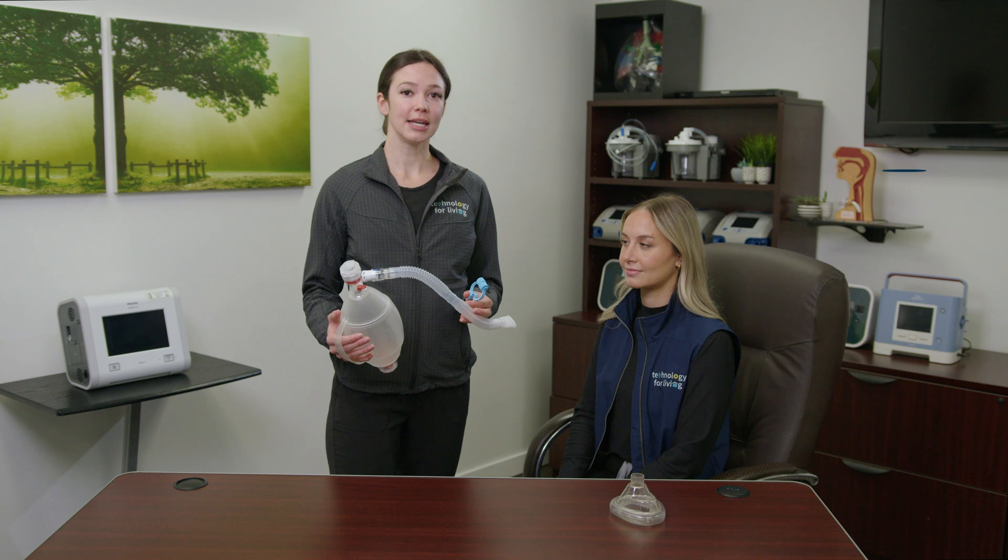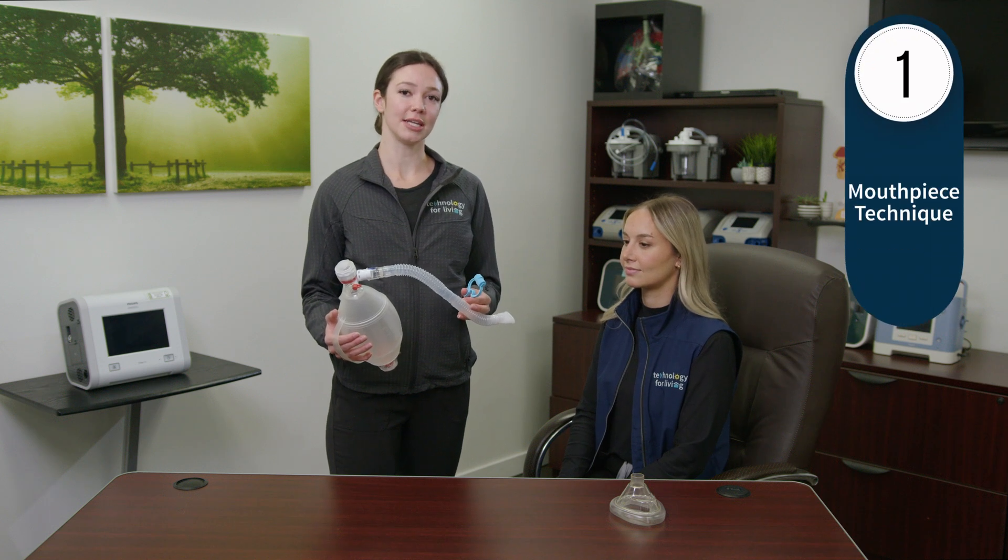The best position for this procedure is a comfortable semi-upright position. First we'll look at the mouthpiece technique, using Elise to demonstrate. This technique can be performed alone, depending on arm strength and dexterity.